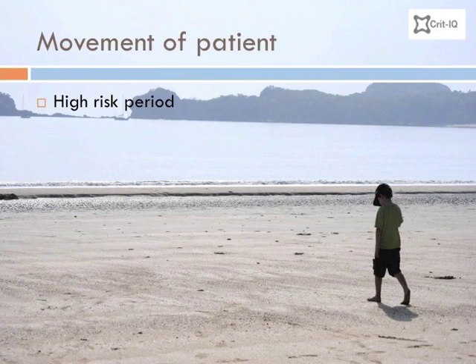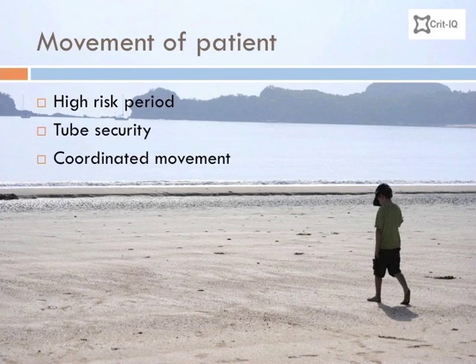This is a well-recognised risk period for the patient. It is very easy for tubes and lines to be inadvertently dislodged, and great care must be taken. Someone must be given the responsibility to manage the patient's head and endotracheal tube. Failure to do this properly can result in endotracheal dislodgement. The cervical spine in unconscious patients, even those without suspected injury, can be subjected to considerable stress if not managed with care. This is particularly true if the patient is paralysed.